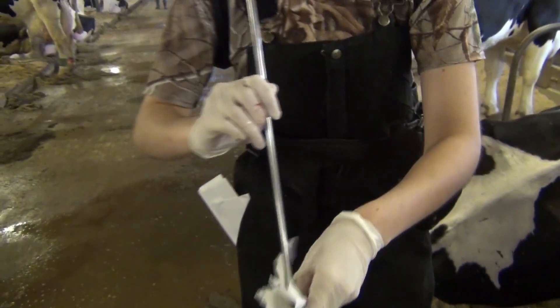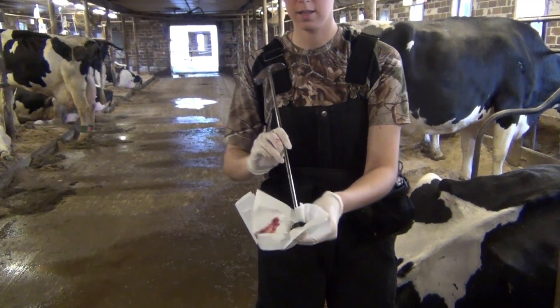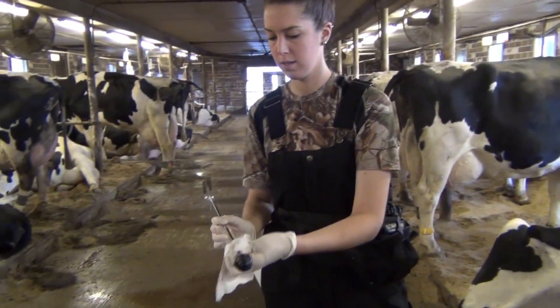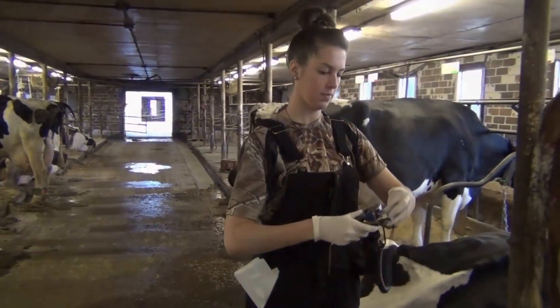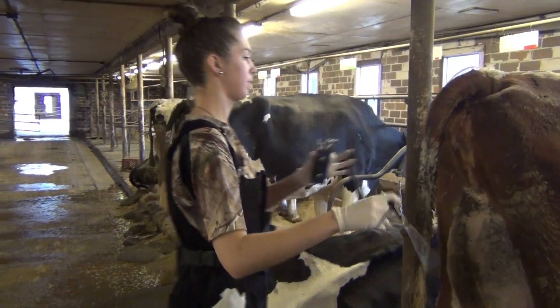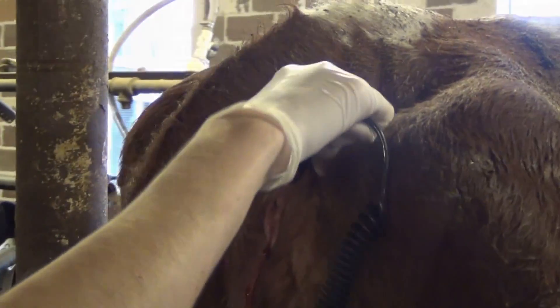Once you are done performing the metritus evaluation, wipe out the hemisphere of the MetroTech device and place it in the disinfectant solution before moving to the next cow. Some cows with metritus may also have a fever, so now would be the time to take the temperature of the cow.